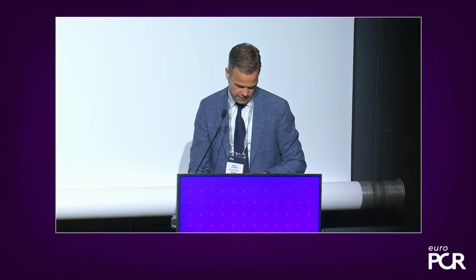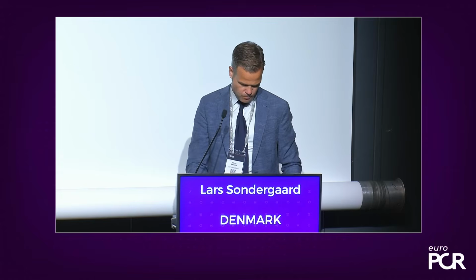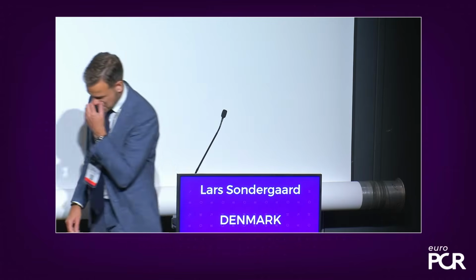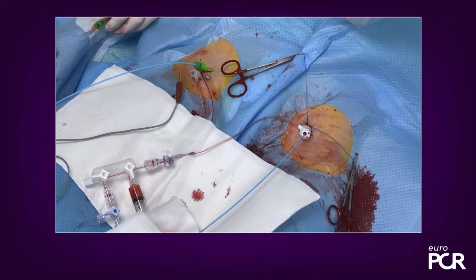So let's go ahead and see how they treated this patient. Yeah, I will start the case. We have one radial access, of course, for the Sentinel cerebral embolic protection. 6 French? 6 French, yes.